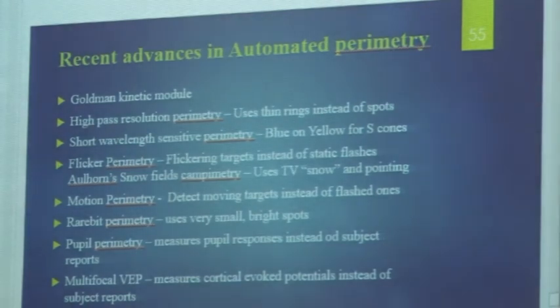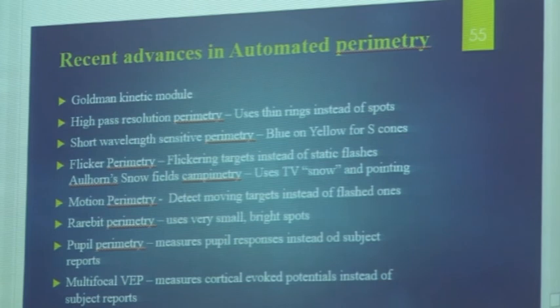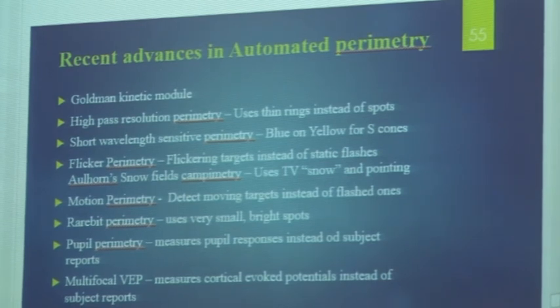Recent advances in automated perimetry are the Goldmann kinetic module, high pass resolution perimetry, short wavelength automated perimetry, flicker perimetry, motion perimetry, rarebit perimetry, pupil perimetry and multifocal VEP.